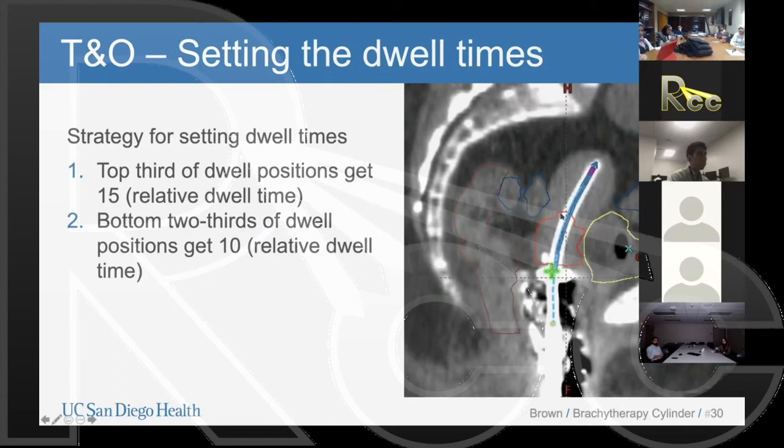And you can think of these as relative times. If you wanted to load 1.5 seconds and 1 second, that's completely fine. If you wanted to load 30 seconds and 20 seconds, also completely fine. We're just talking at the moment about relative times.